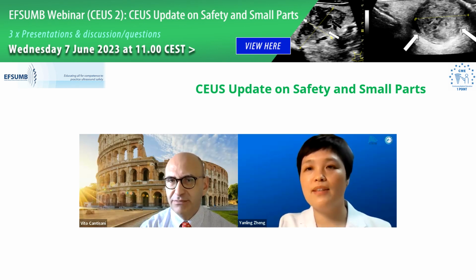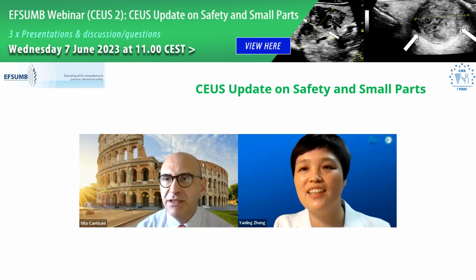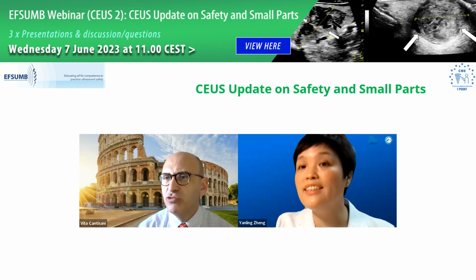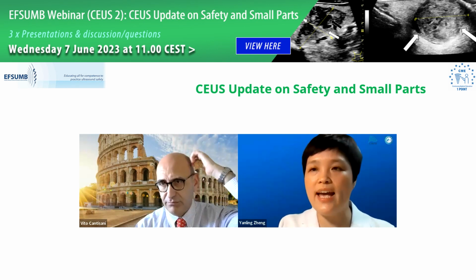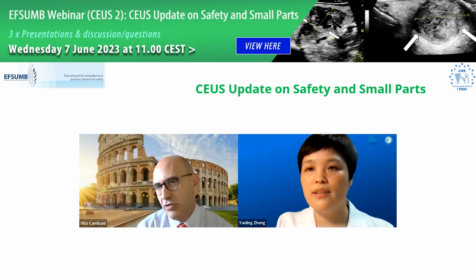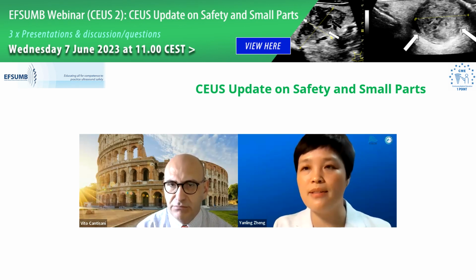Before injecting the dye at the areola, how do we estimate the lymphatic drainage? The lymphatic ducts? We just follow the enhancement duct. We can't find the duct on grayscale, just on enhancement, and we can follow that. So you don't evaluate before injecting? No, just during the enhancement, after injection.